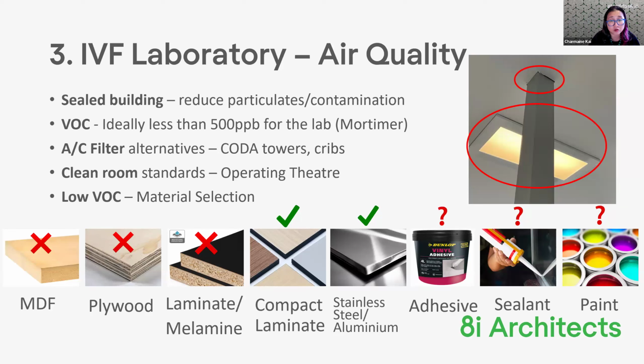Making sure that you do your critical work within cribs is actually a cheaper alternative than trying to do the whole lab space. So it's something to consider for still getting best practice results, but without the expense of basically air conditioning a whole lab space to critical standards.